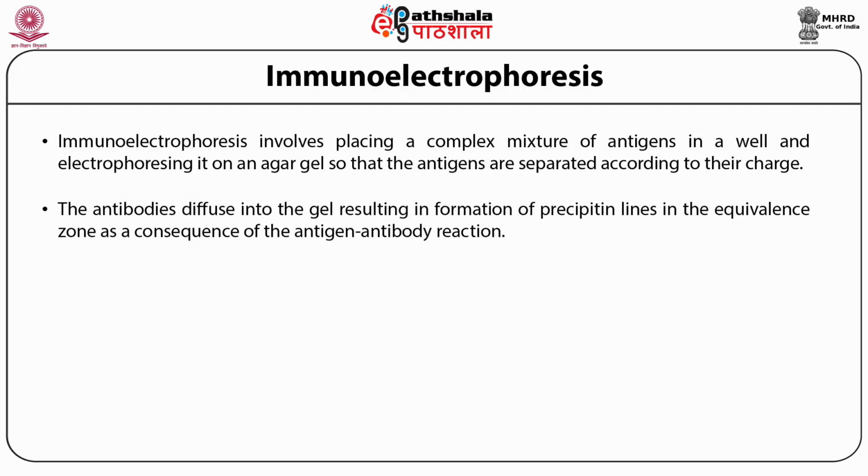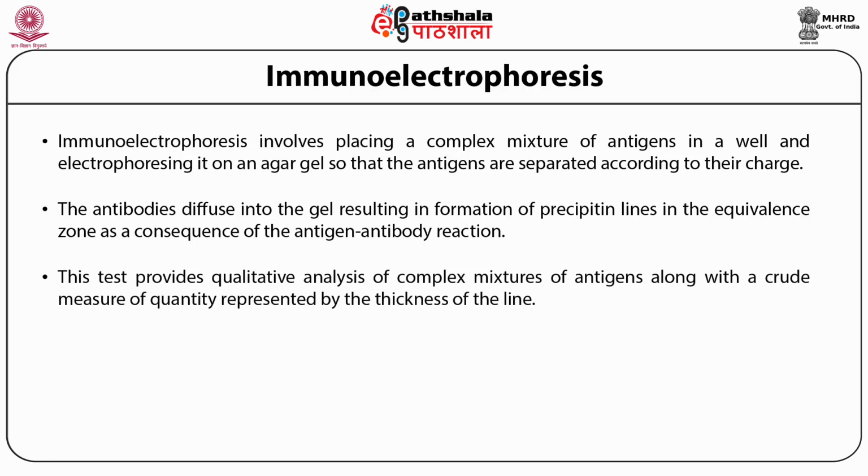The antibodies diffuse into the gel, resulting in formation of precipitin lines in the equivalence zone as a consequence of the antigen-antibody reaction. This test provides qualitative analysis of complex mixtures of antigens along with a crude measure of quantity represented by the thickness of the precipitin line.